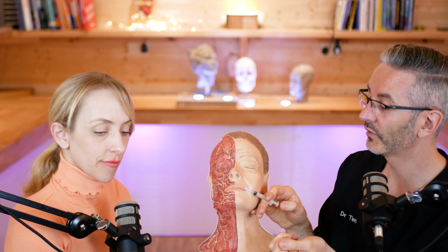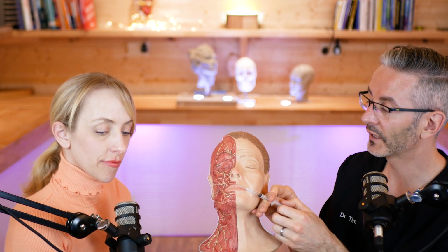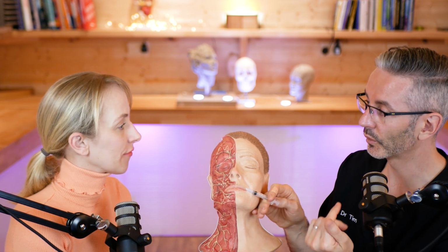So you can aspirate once at the beginning. You could do a little linear thread, and then you can stop and aspirate again, so long as you're using a filler that you know aspirates. And we've tested this. Maybe we can put that link in the bio.